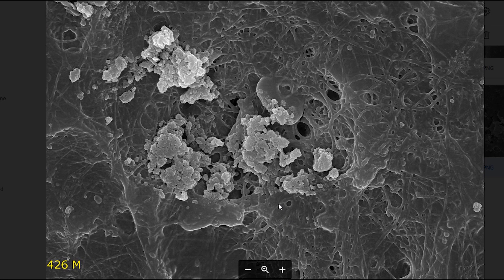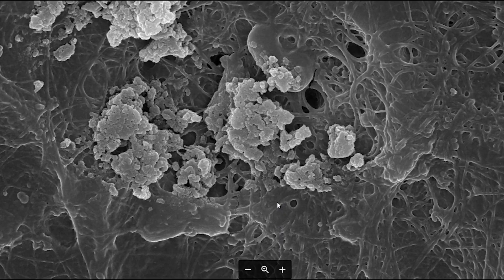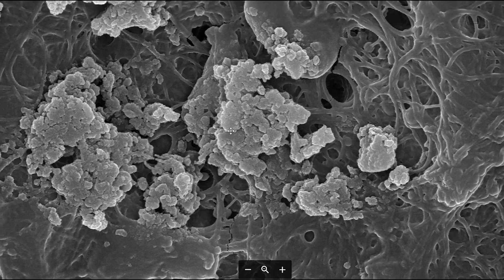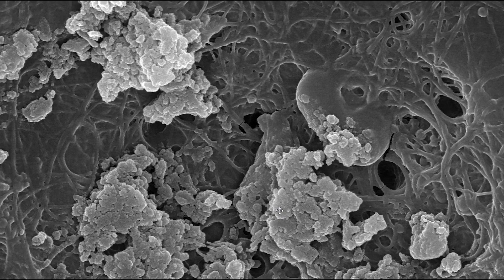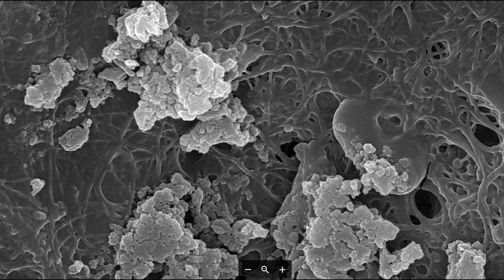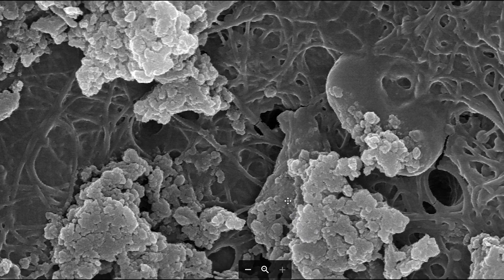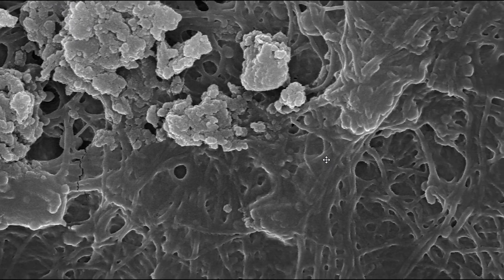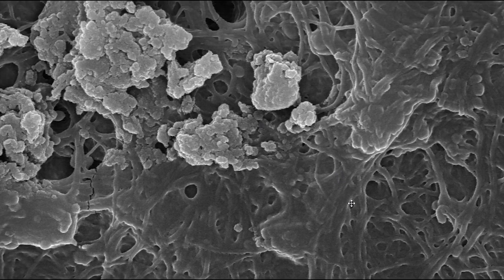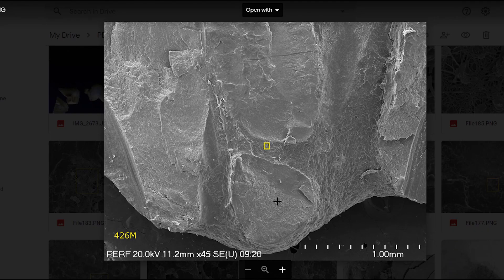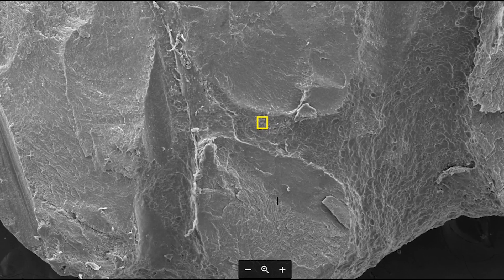Going into areas at higher magnification that may look similar to biofilms — when you look at them closely, you can see these are just calcospherites. They are not bacteria. They are calcospherites. As the dentin decalcifies with the EDTA, it comes off in chunks, and you can see various calcospherites throughout the entire canal.